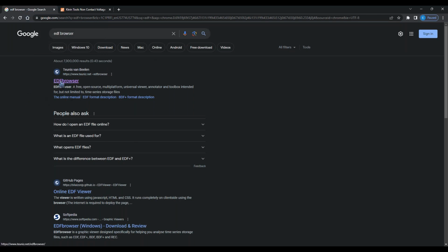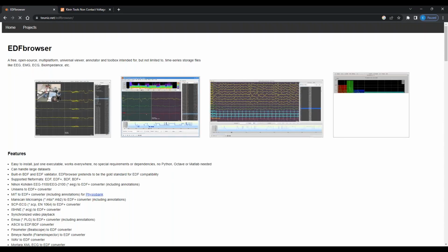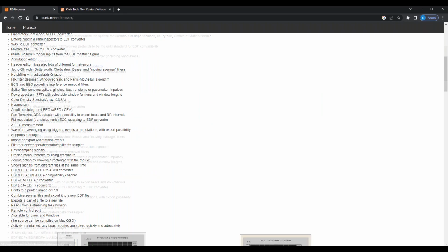So that got everyone thinking, do we want to spend the time and energy finishing up the coding in the software to allow playback, or do we just let that go? You can save an EDF file from a training session and play it back, but currently not through the actual software.